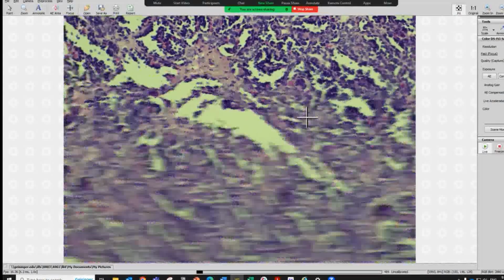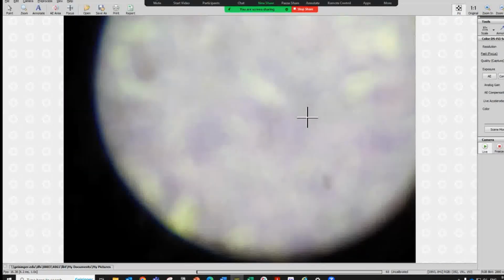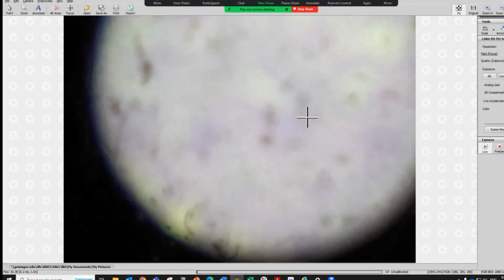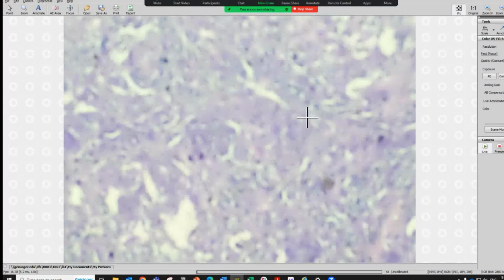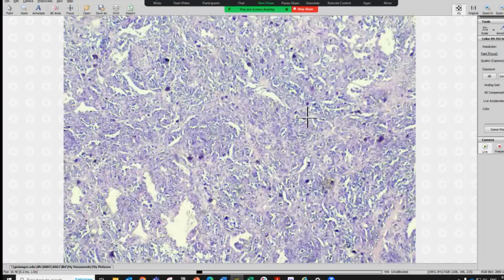So this one, basically, I just would like to show you this papillary structure. Wilms tumor can form mainly papillary structure, so you always need to have this differential in your mind.